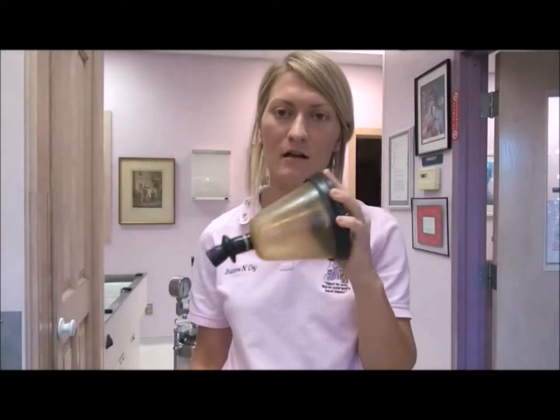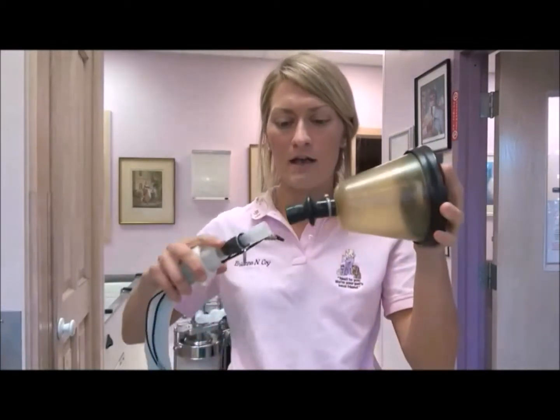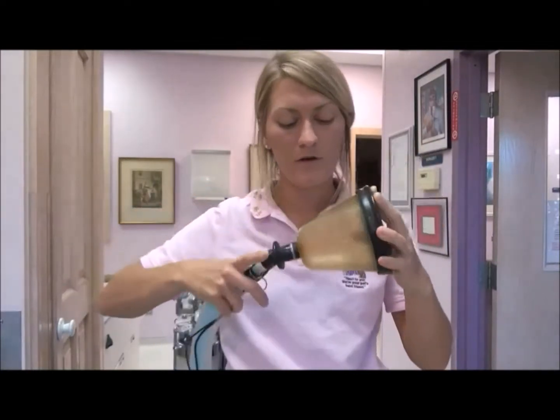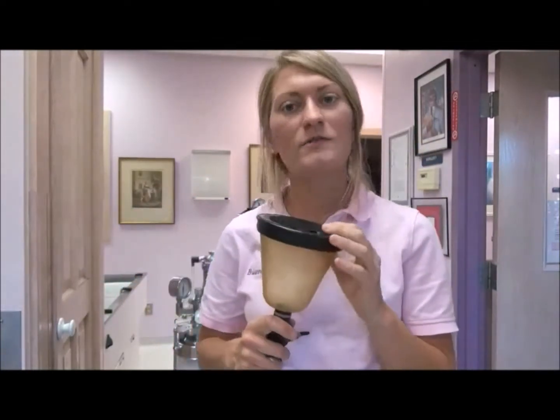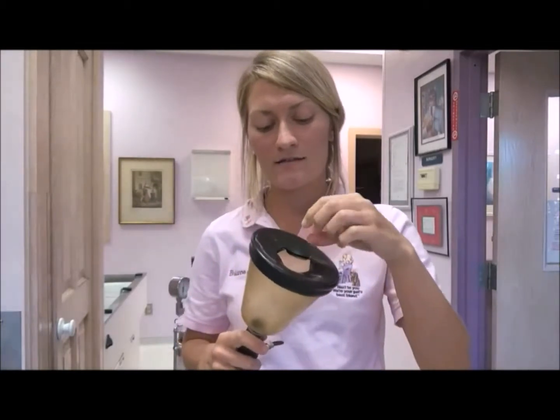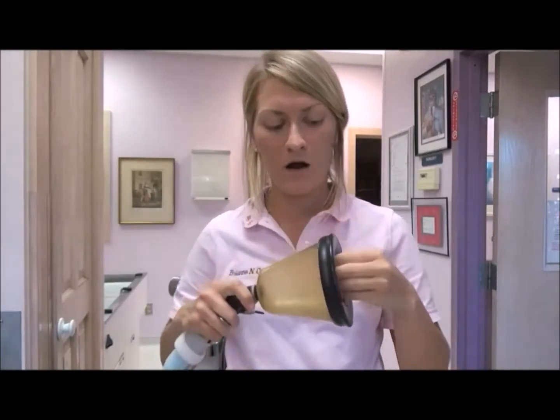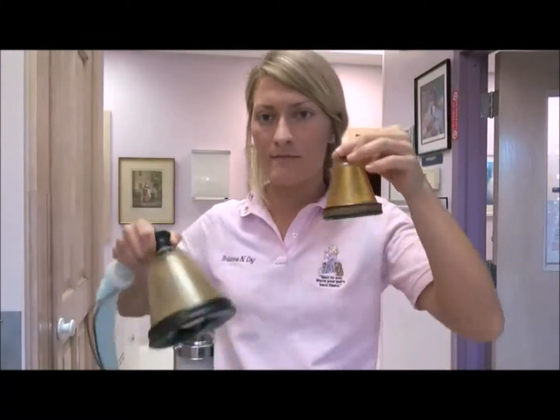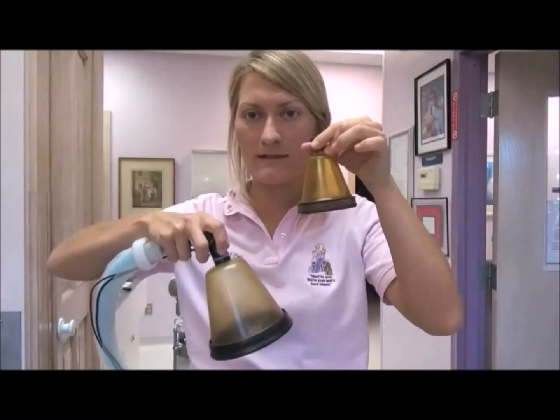When inducting a patient, we use a mask. The mask fits snugly around the patient's face, and the opposite end connects to the rebreathing tube. It's really important that you choose an appropriately sized mask to help prevent waste anesthetic gas from escaping around the patient's muzzle. Sometimes we'll use a smaller one if we have a really tiny animal.